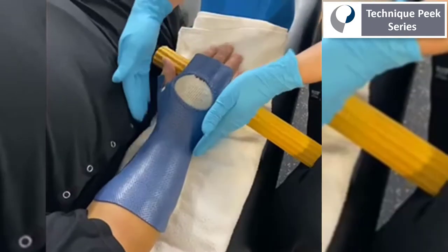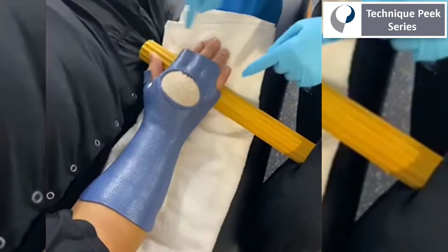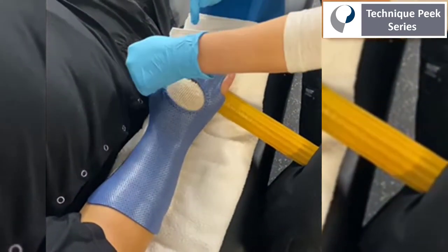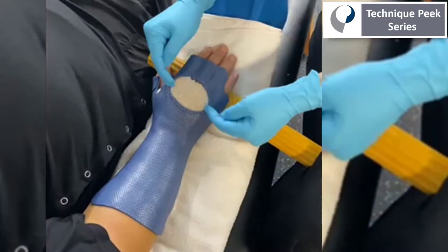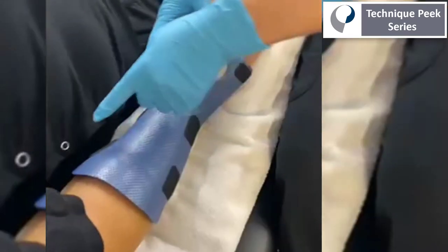This material is thin and well-tolerated by patients, as opposed to the traditional dynamic splints with big outriggers for radial nerve palsy. It's much more usable in the long term while waiting for the radial nerve to regenerate.